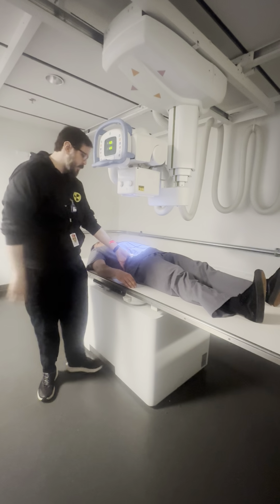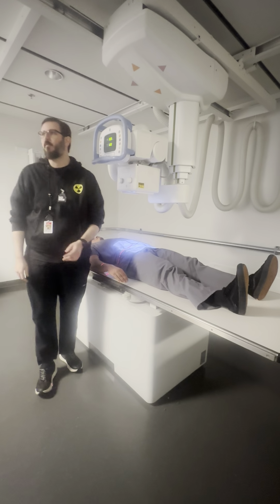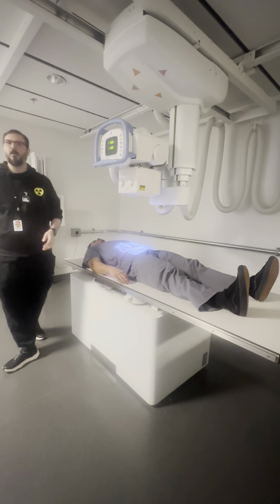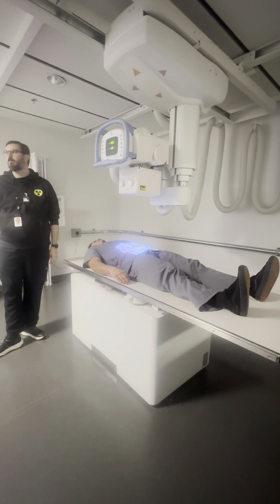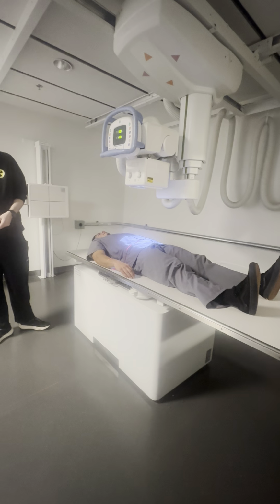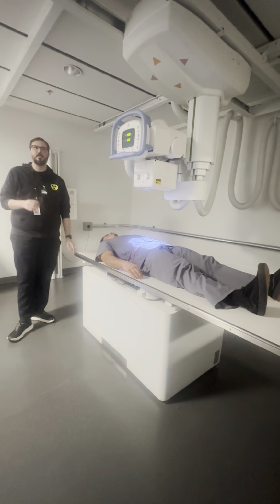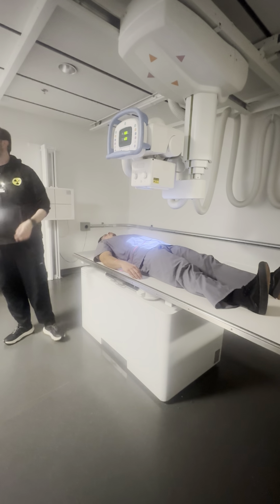The real trick to this isn't can you go up and down. I don't really care about that. You're not impressing me that you know to go 2 inches lower. Instead, when do you go down? What is considered delayed? Throw something out there. 1 hour. Okay, so 30 minutes. What about a patient who has really slow transit? They have bad gut motility.